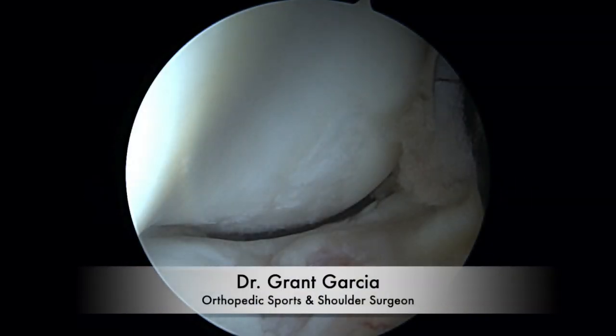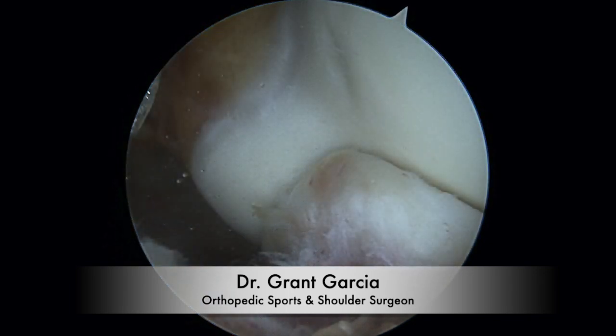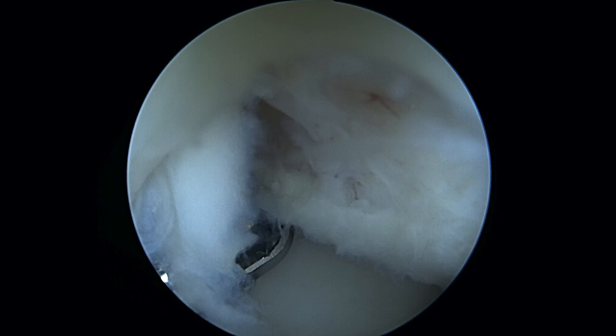Here we're in the anterior compartment. This patient had a previous fall with radial head damage. In addition you can see the olecranon here. Here's the OCD with the loose fragment.